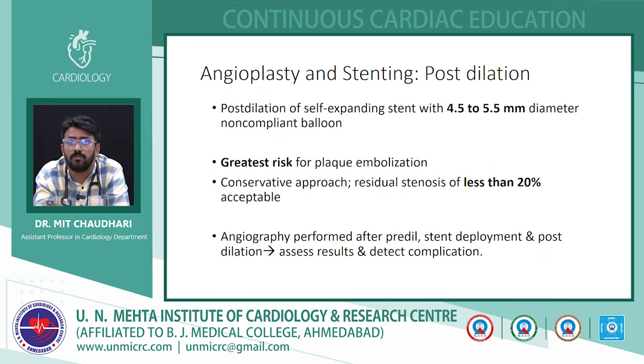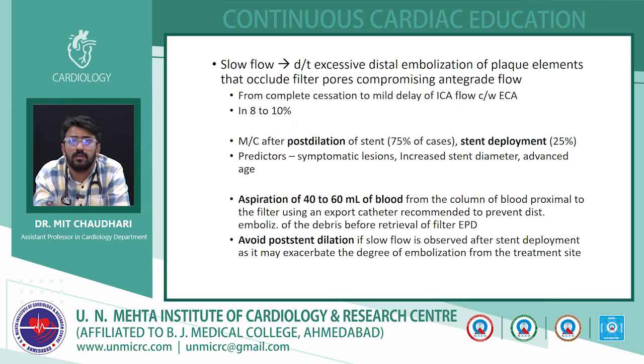Many operators also give atropine and fluid beforehand, before dilating, and then they dilate, put in a stent, or consider post dilatation. As I was saying, after putting in a stent or doing a post dilatation, sometimes there is slow flow.